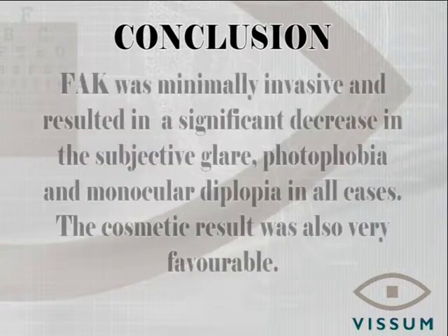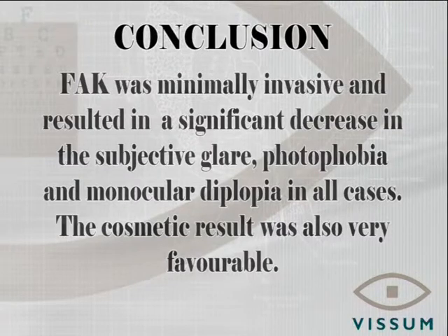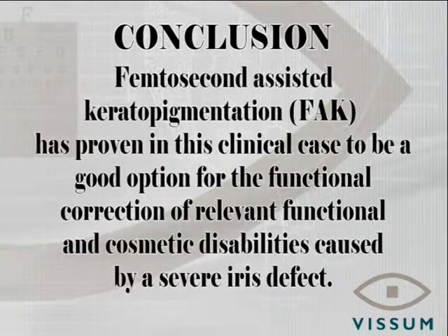This is a minimally invasive technique and has resulted in a significant decrease in the subjective glare, photophobia, and diplopia in this case. The cosmetic result was outstandingly good as appreciated by the patient, and this technique offers a good option for functional correction of severe disabilities caused by different iris defects in the future.